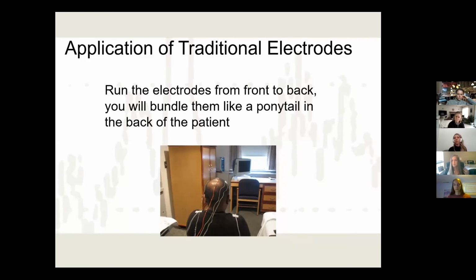Okay. There's both. Some you only make one mark, and then later in the hookup, you'll end up coming back and crossing that mark. But others on the worksheet, it tells you, hey, just make a cross here. And when it tells you to make the cross, for example, I think on C3 and C4, it tells you to cross them. So you just really want to line that up with your marking up here. That's what I was saying, visually look at the head and you can see where the line should meet up, and that should help you make the exact crosses.